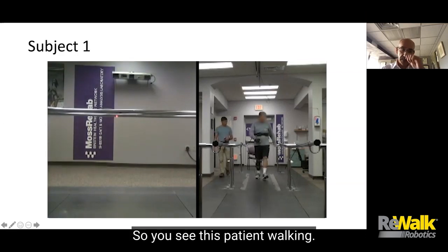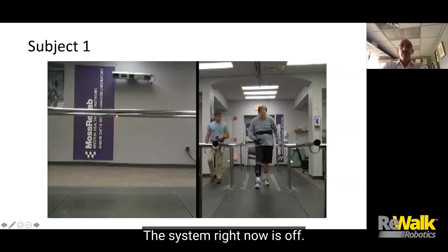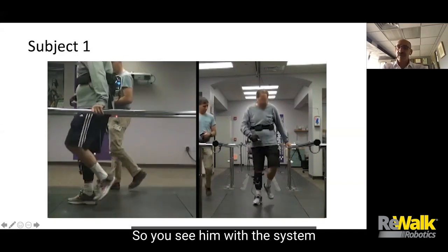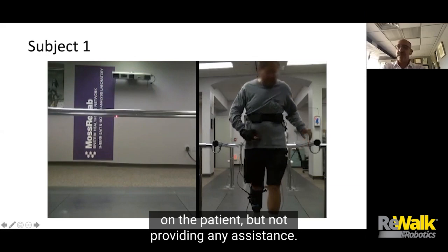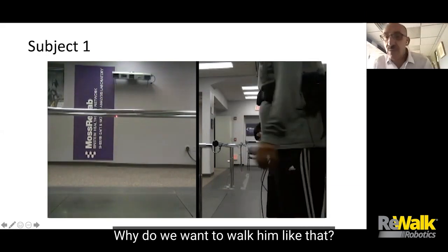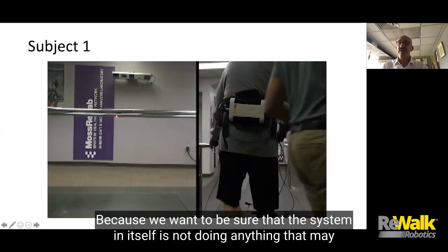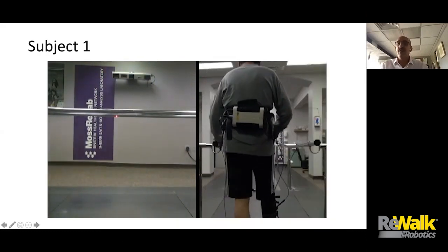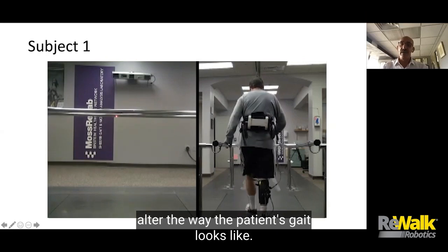So you see this patient walking. The system right now is off. You see him with the system on the patient, but not providing any assistance — we shut the system down. Why do we want to walk him like that? Because we want to be sure that the system in itself is not doing anything that may alter the way the patient's gait looks like.